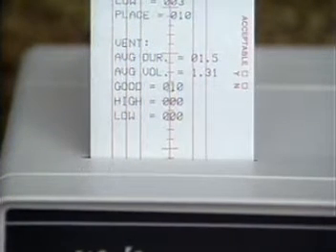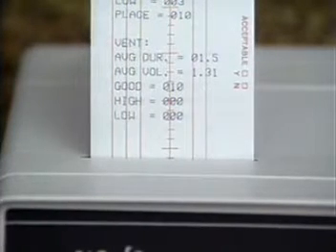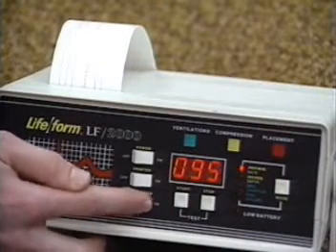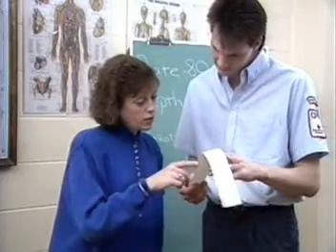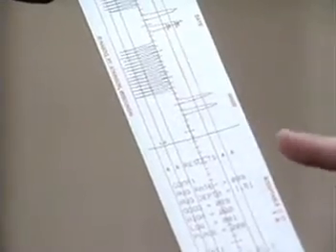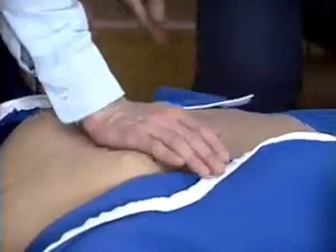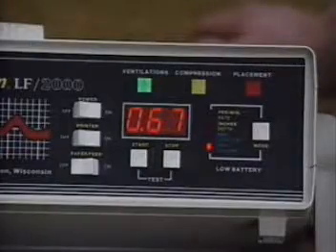The printout analysis also includes the average duration for each ventilation, as well as the overall average in ventilation volume. Again, as with compressions, the total number of ventilations that were good, too high, or too low are indicated. The objective analysis of the waveforms eliminates counting peaks and estimating rates on a graph. Your results are printed in a simple and straightforward manner. When a printed tape is run with CPARLENE in the child mode, all of the performance levels are adjusted to those standards that apply to child CPR.